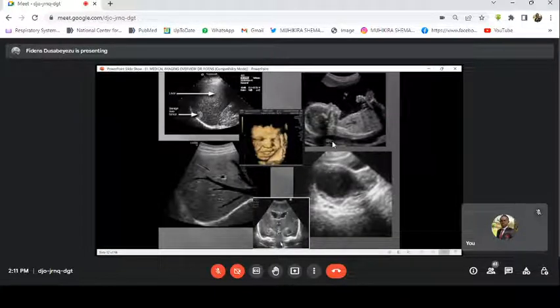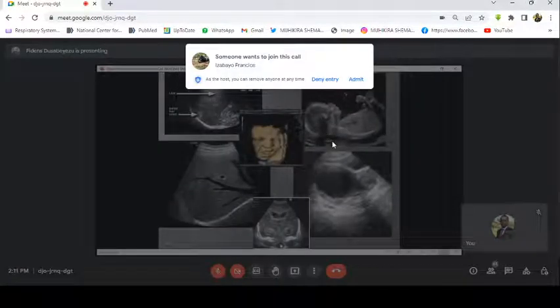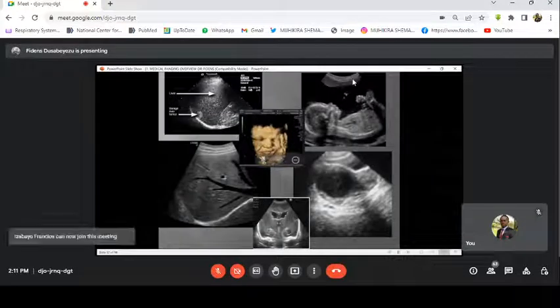All right. So have you understood those terms? Hypoechoic, anechoic, posterior acoustic shadowing, posterior acoustic enhancement. Now you understand them very well. All right.